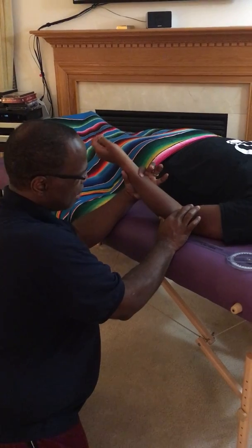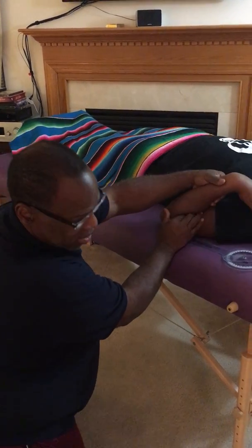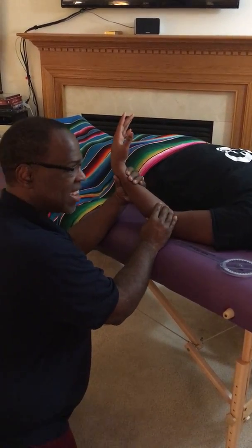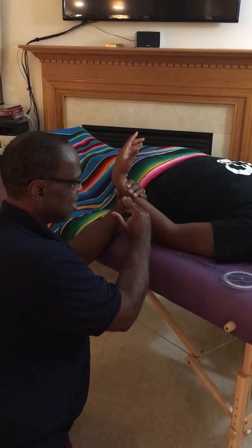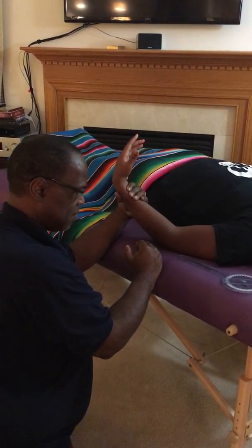If I'm talking about flexion, it is, in our example, 40 to 165. If we're talking about extension and she tries to extend her arm and it doesn't go anymore and I haven't made it to the neutral point yet, then she is in negative 40 degrees of elbow extension.